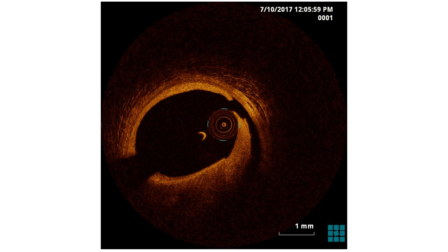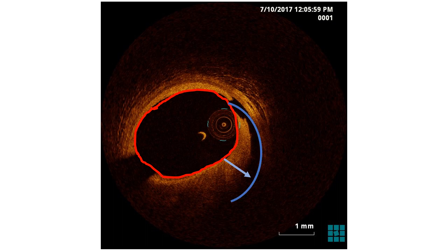There are a few important things to consider when we face stent edge dissection. First is the luminal area — the lower the luminal area, the more significant the dissection. The depth of the dissection is also important, and whether it involves only the intima or also extends to the media. The arc of the dissection can be calculated from the center of the artery, and the length of the dissection can be calculated from the longitudinal view.